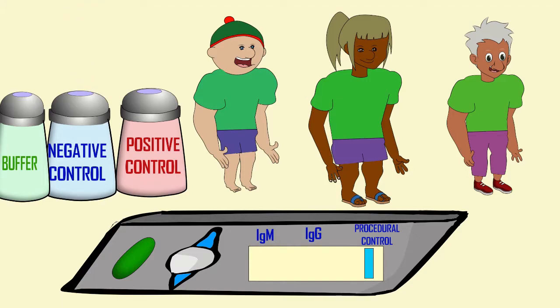In addition to this procedural control, you would also want to run a negative control. Here is a sample which does not have antibodies for coronavirus, and your test result should then say that this sample is negative.